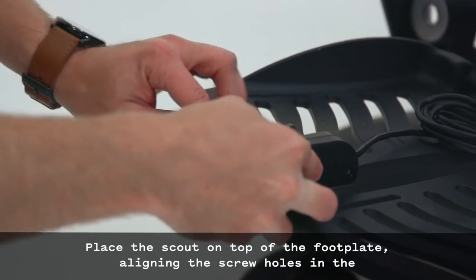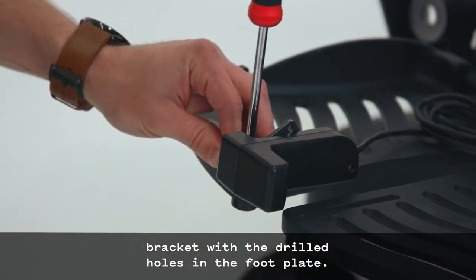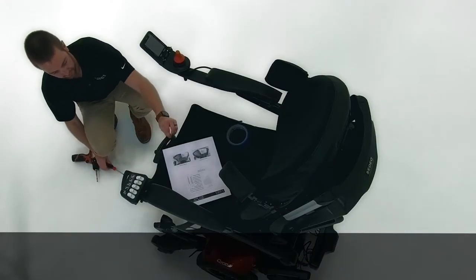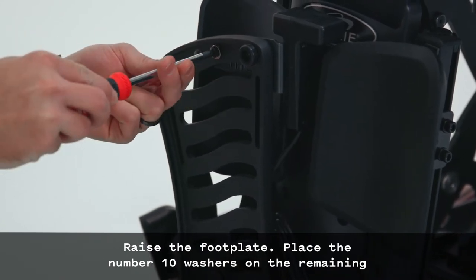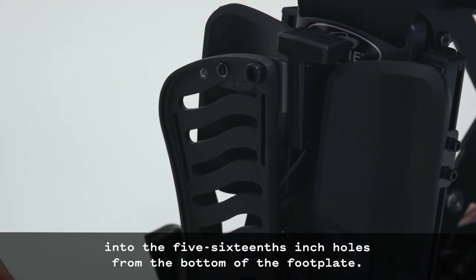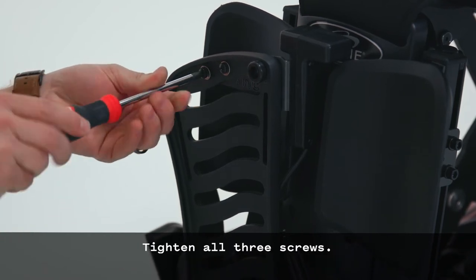Place the scout on top of the footplate, aligning the screw holes in the bracket with the drilled holes in the footplate. Loosely reinsert the M5 x 8mm screw into the threaded hole. Raise the footplate. Place the number 10 washers on the remaining two M5 x 8mm Phillips-head screws and insert them into the 5/16-inch holes from the bottom of the footplate. Tighten all three screws.